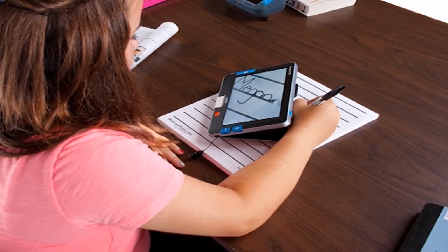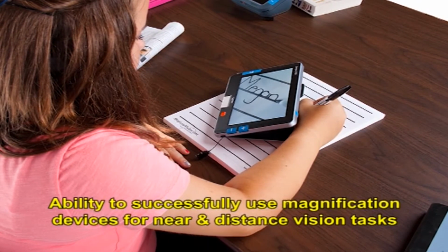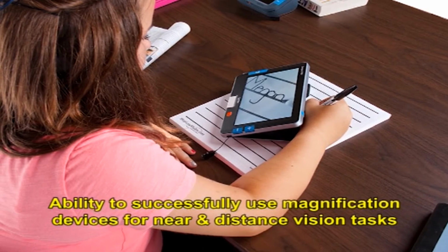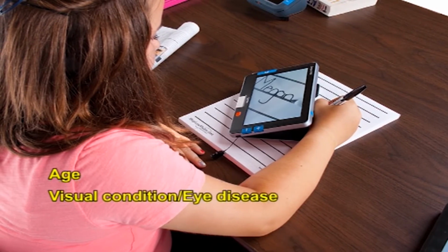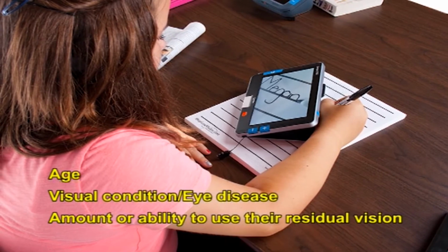People with low vision vary dramatically in their ability to successfully use magnification devices for near and distance vision tasks. Their ability will vary based on age, visual condition or eye disease, and amount or ability to use their residual vision. Low vision devices are frequently categorized as optical, non-optical devices and electronic devices.